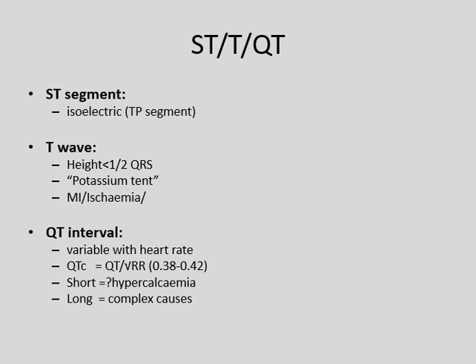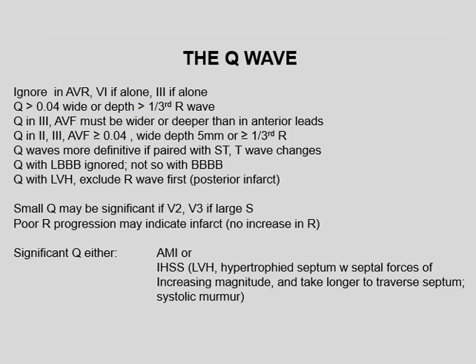The last part that we look at in evaluating the ECG is usually the ST segment. Is it elevated or not? Is it showing ischemia or infarction? We look at the T wave to see whether it's elevated or not, or inverted. And as we just saw, we look at the QT interval in terms of determining potentially lethal arrhythmias, which are often associated with congenital defects. Be aware of all these different measurements we must take and observations we must make, and the evaluation of the ECG should become fairly well automatic.